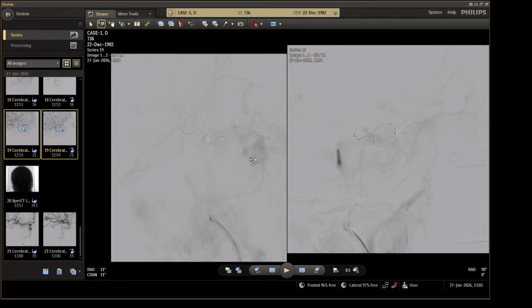Yes, that's why the short 3.5 millimeter flow diverter could be an option, but the problem was Headway. Huh? And Squid 1.6... Okay, I asked Rowan to take a Squid 12.